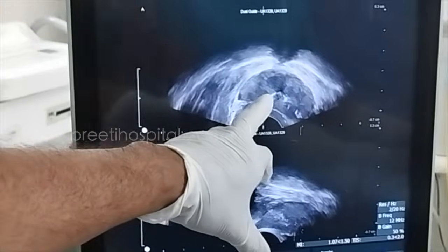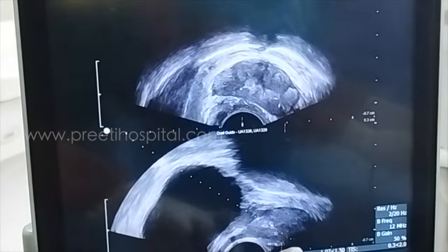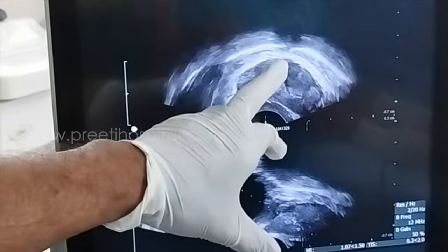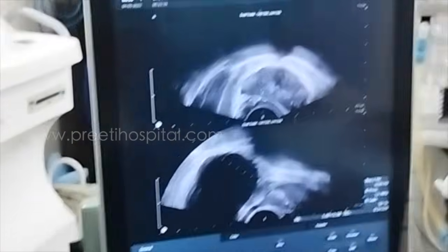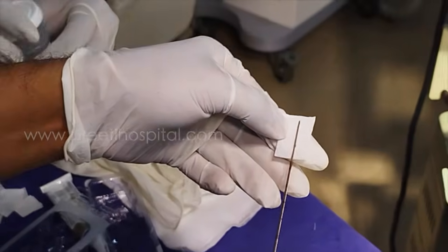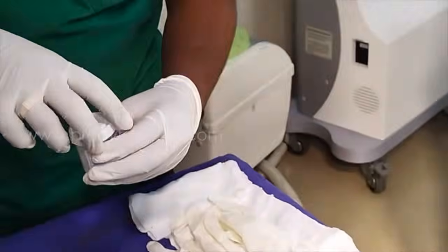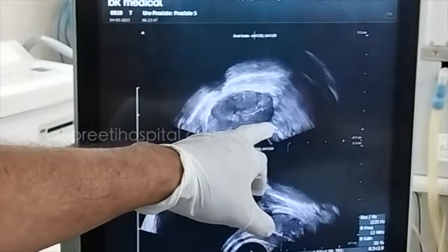Now clockwise towards the middle part of the prostate, sagittal section, transverse section. This needle will enter here and go obliquely like this. The patient is not wincing, which means the anal sphincter is not involved in this part. This is not under infiltrative anesthesia. Now we have moved more clockwise.